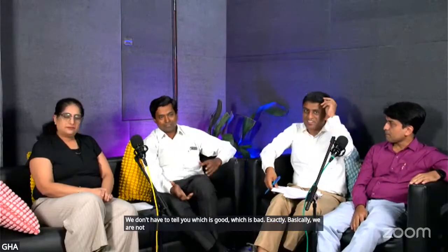Yeah, there are some very bad quality machines and very good quality machines, but you can make that out by looking at it yourself. We don't have to tell you which is good, which is bad. Exactly. Basically, we are not here to endorse any machine. As explained, based on your requirement, whether you want to see the full skull or the full mouth, depending on the FOV you are using, and serviceability, that is the biggest thing. As Dr. Joshi told, today they sell the machine, tomorrow they are not there. Where do you go? You have invested so much and you can't go anywhere. So these are the things that can drive what you want to buy.